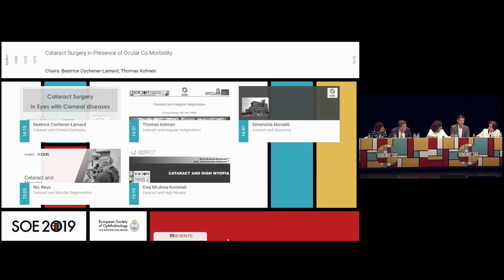For the painter, yes. And also there are some studies that the blue filter blocks melatonin synthesis in the patients. On the other hand, patients implanted with yellow IOLs have some problems sleeping at night because they don't have enough melatonin, as the blue filter blocks the melatonin synthesis. But the thing is, those lenses are comparable to a 30-year-old lens. Well, I'm about 30, but I don't have the impression that a lot of people above 30 have lots of problems with sleeping at night. So I find that's a controversy.